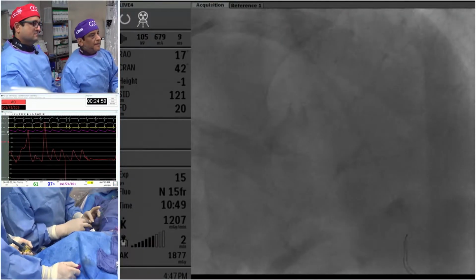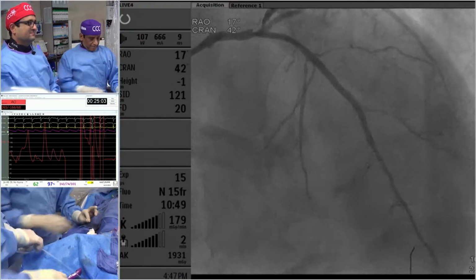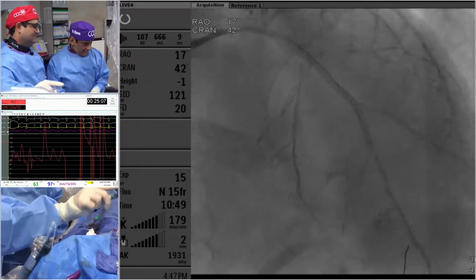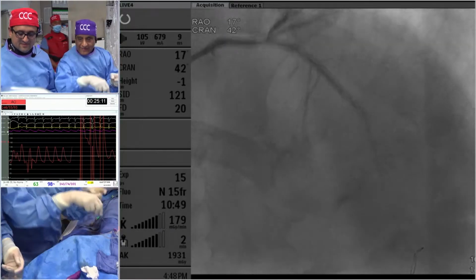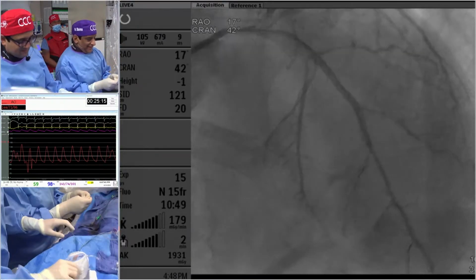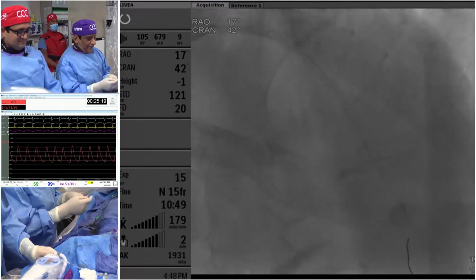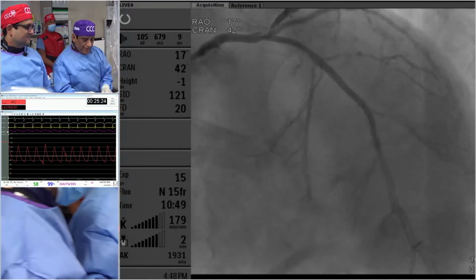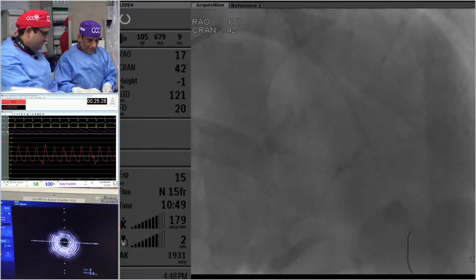Okay, let's see here. Dr. Sharma, can you do me a favor and fix this nasty lesion in the left main? It looks to me like an eccentric lesion, right here. You want OCT or IVUS? IVUS is ready, please. Listen, it really looks eccentric and nasty. We'll do it. Pull your wire back. The key is that one imaging is a little too much for Sharma, as you know.